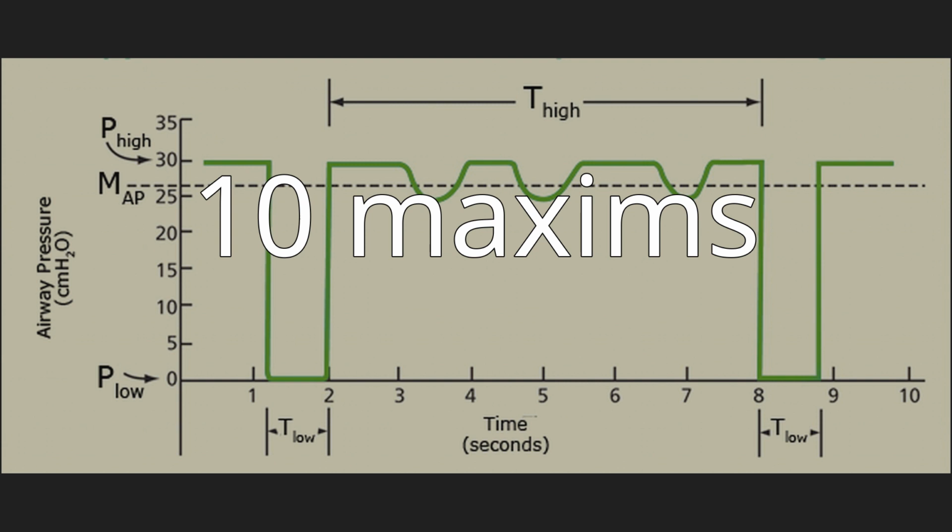Spontaneous breaths may occur between mandatory breaths, and continuous spontaneous ventilation (CSV). All breaths are spontaneous. There are 5 basic ventilatory patterns: VC-CMV, VC-IMV, PC-CMV, PC-IMV, and PC-CSV. The combination VC-CSV is not possible because volume control implies machine cycling, and machine cycling makes every breath mandatory, not spontaneous. A 6th pattern, TC-IMV, is possible but rare.